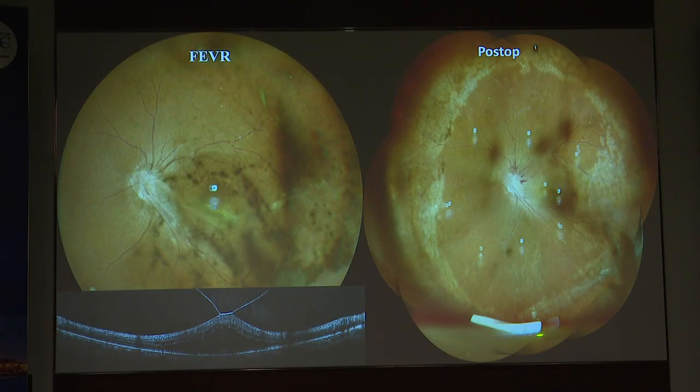So we had to do a vitreous surgery. We had to treat even the periphery. This is an Ozurdex implant as well. So a case of epiretinal membrane, yeah, FEVR. There was a vascular tissue which I could see through it. Somehow I misplaced this particular angiogram. We are not able to place it. And so when we went for vitreous surgery, we had to target and treat this part also of the disease. That is what we learned.